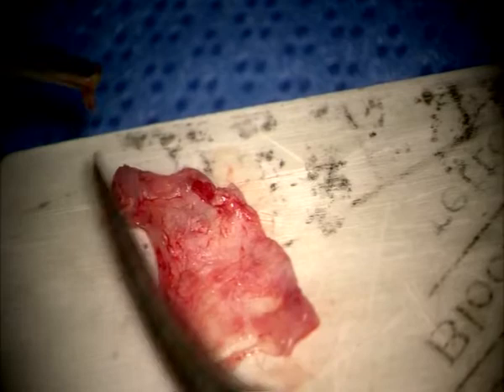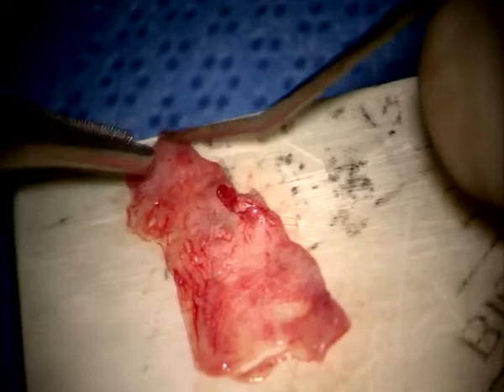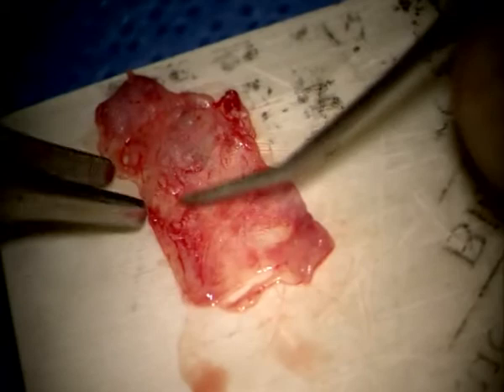Takes it. House. Well, this is definitely the skin side. You could see the epithelium.